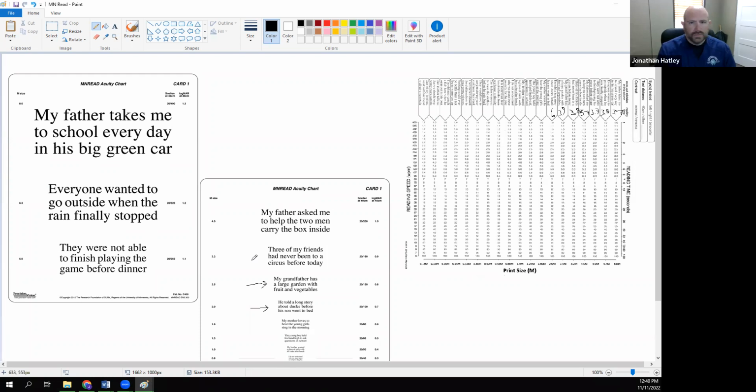All right, so we're starting to slow down a little bit. We see that the patient is struggling a little bit in order to read these sentences. And now we're getting to the point where we know we're getting ready to reach what's known as our minimum size, or the threshold. So let me reset my stopwatch. We're going to read the 1.6 M now. And we tell the patient, on your mark, get set, go.